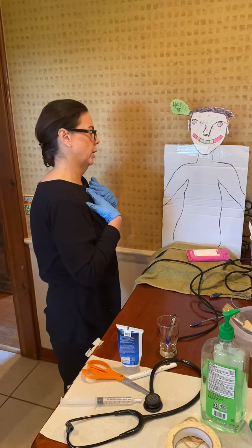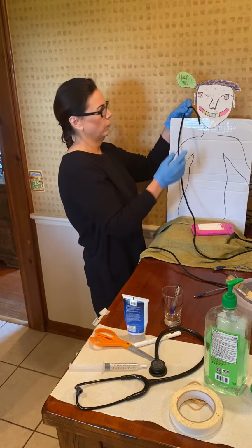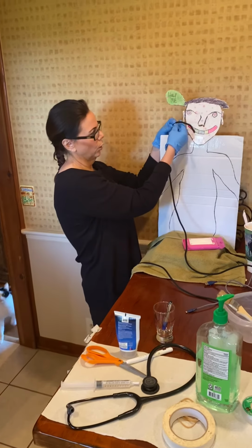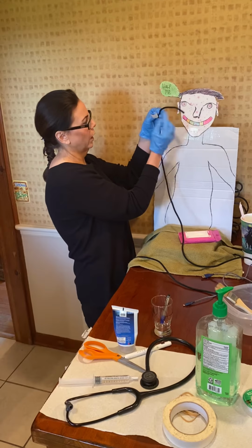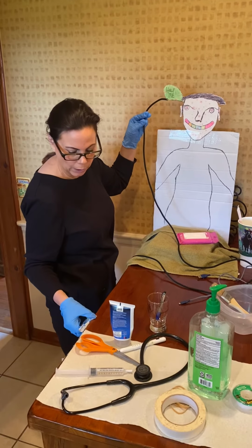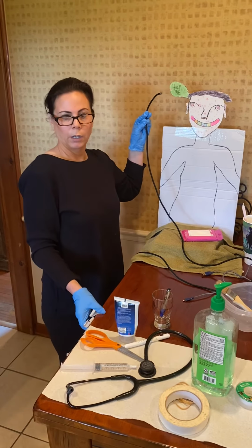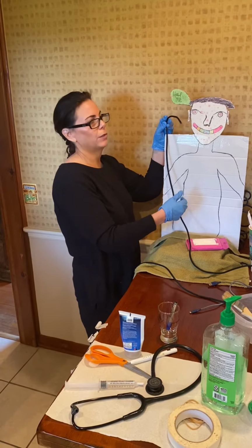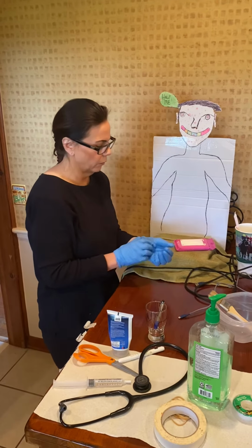Now, to go back, this would have been taped to his cheek. And as I did this, we would use the tape and tape this to his nose. Tape I've got here, but it's not the clear kind that I would use. So we would loop it around and tape it to his nose. After correct placement is verified, I would secure the tube and mark it with a permanent marker. Then I'm going to take off my gloves.